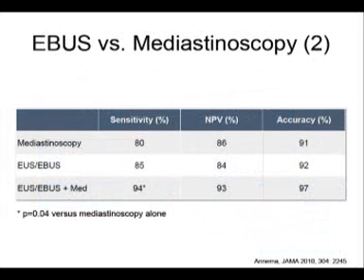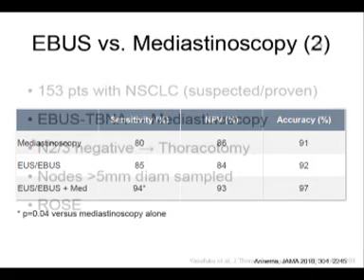Next. These are the sensitivities, and you can see that the combined procedure using EUS, EBUS, and mediastinoscopy had the highest sensitivity and accuracy. Next, please.